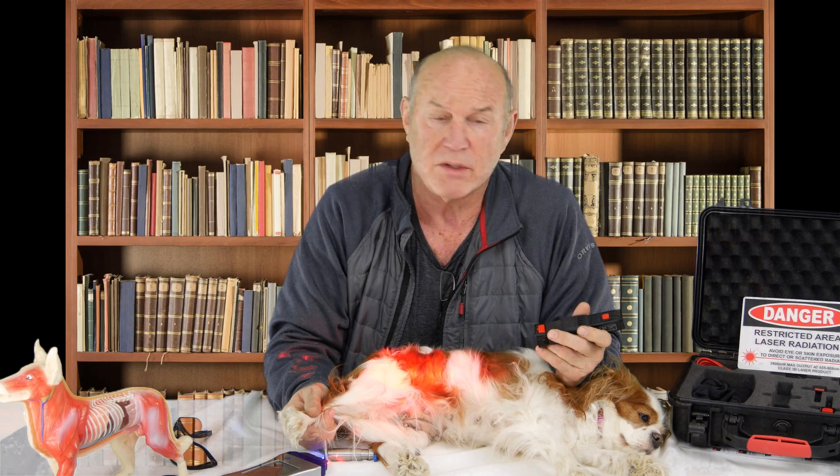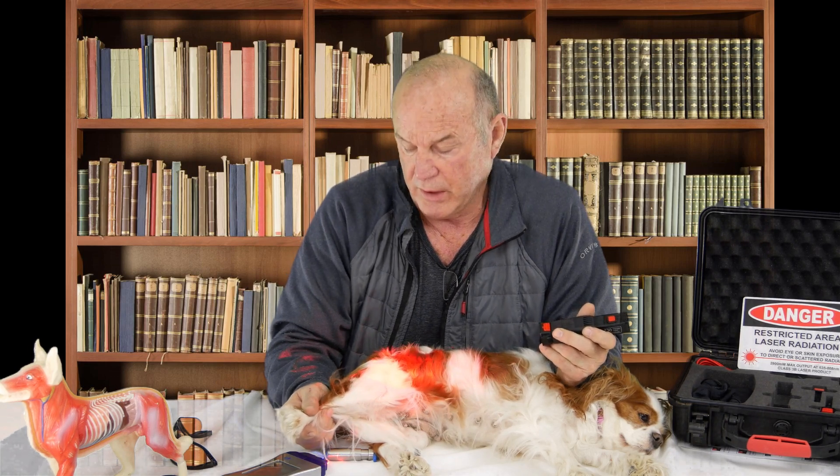Notice that we're treating this whole area. I mentioned the condition actually occurs in the lower back, and the frequency sets we're using here will also impact the lower back. By the way, Star is snoring right now.